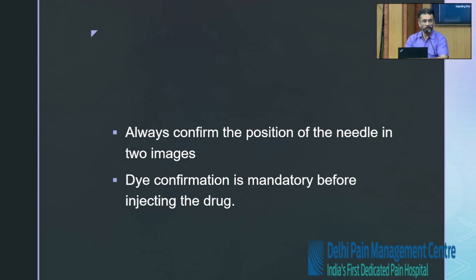Second, since we are converting a three-dimension into a two-dimension, we need to confirm the needle position in two images. For example, if I'm trying to touch the tip of my nose, people standing or sitting there will say yes, I am able to touch it, but a doctor sitting here will say no, there is a gap. Therefore, always try to confirm in a minimum of two or even more images. Whether I'm touching it from here, up or down, all the images should show that I'm there. So do not be in a rush; confirm it in two or multiple images.